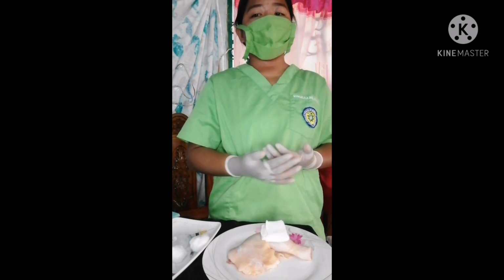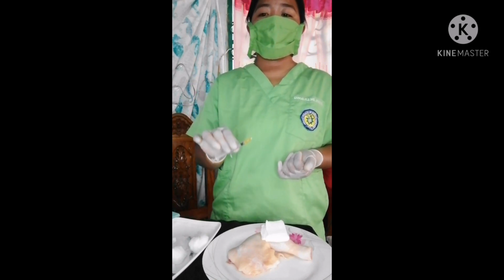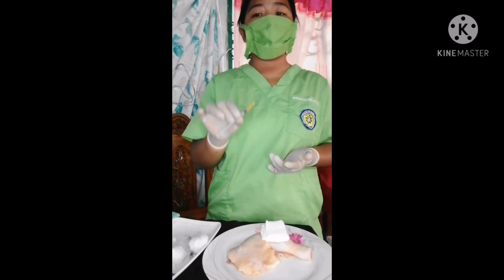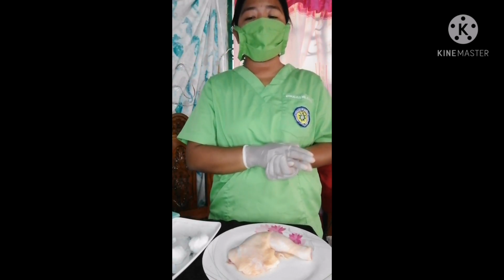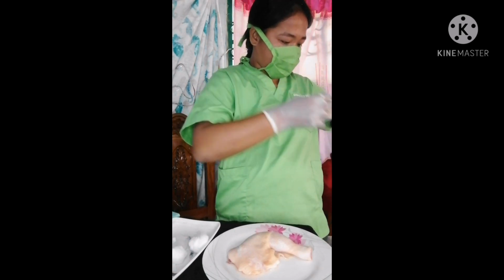Do not recap the used needle. Engage the safety shield or the needle guard if present, and discard the needle and syringe in the appropriate receptacle. Assist the patient to a position of comfort. Remove the gloves and dispose of them properly, and perform hand hygiene.